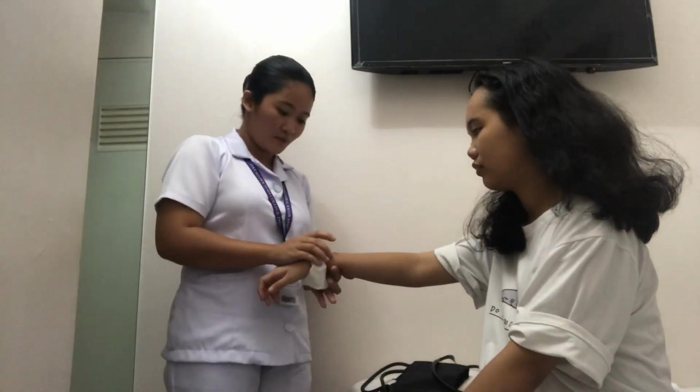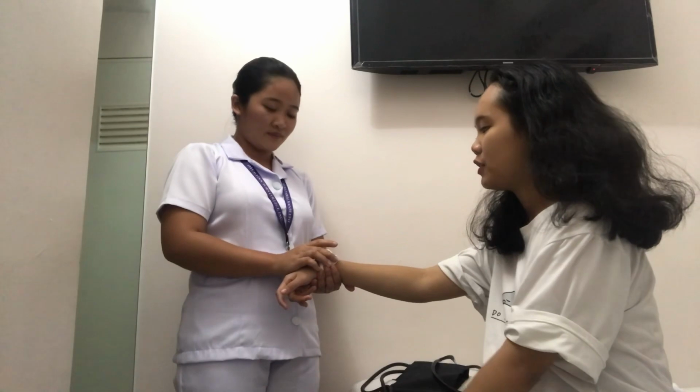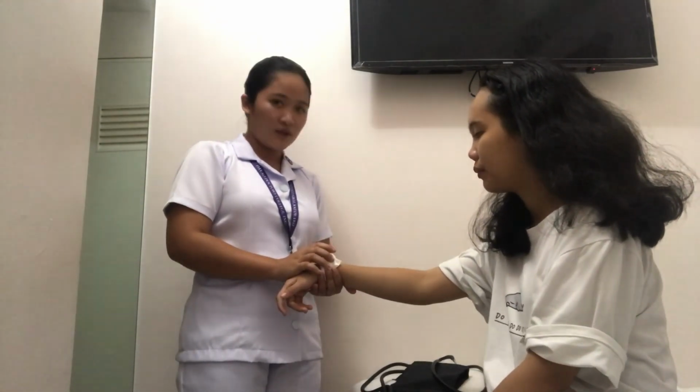Hello, ma'am. My name is Kate Bayansi Icona, your student nurse for today. So, ma'am, can I see your wristband? So, please state your name and your birthday, please. My name is Mia Monica Peralta. My birthday is on June 15, 2003. Okay, thank you. Okay, now I'm going to pull up your sleeve so I can put the thermometer.